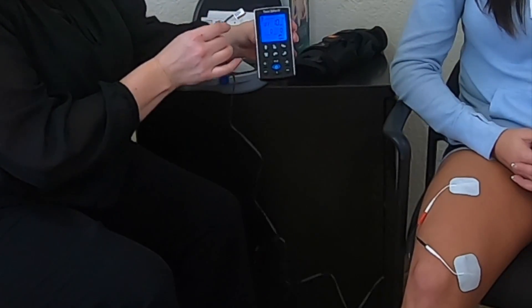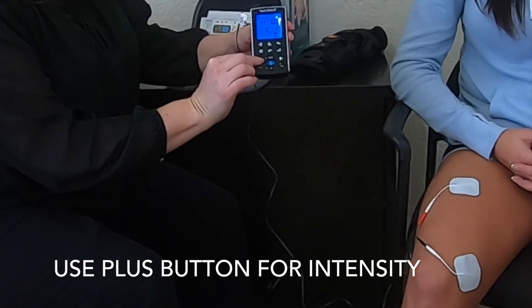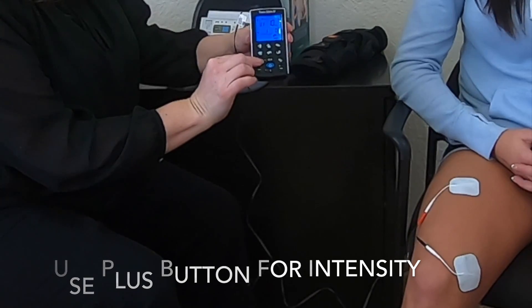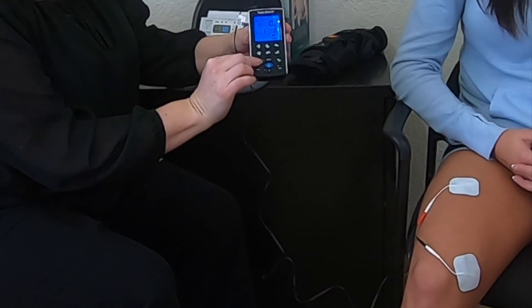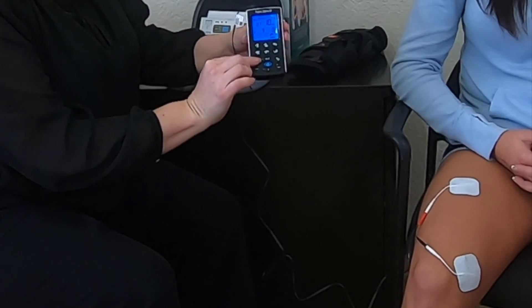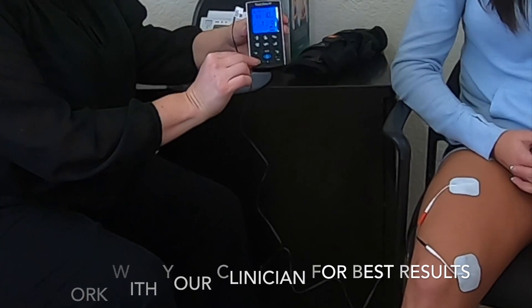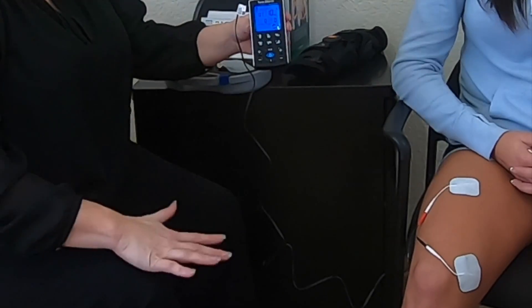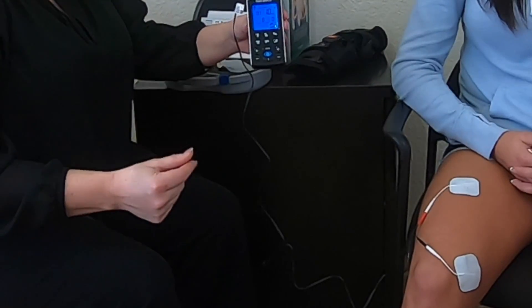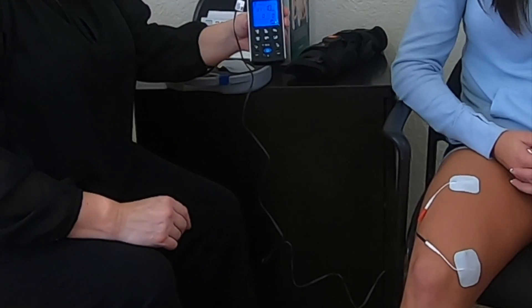Use the controls on the side of the device you're plugged into. Since you're only using two electrodes, turn up your intensity until you see that contraction. You're typically going to do this along with some exercises, so please refer to your therapist as to when and with what exercises. If this starts feeling uncomfortable and you want to turn it off, hit the power button — that takes the milliamps down to zero immediately and you can start over. That's the NMES setup for our MedStar device.